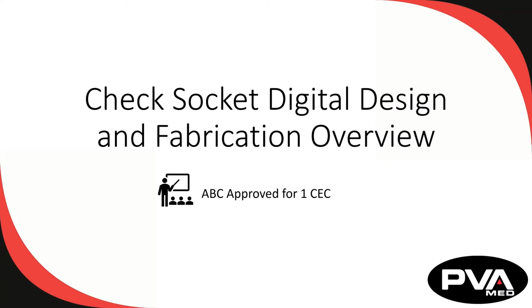This module is ABC approved for one continuing education credit earned upon successful completion of the quiz at the conclusion of this program. Advances in additive manufacturing, or 3D printing, and materials advances have enabled practices to fabricate check sockets as designed automatically. Comprehensive training, well-defined workflows, and fully integrated standards-based platforms have positioned 3D printing for the O&P mainstream.